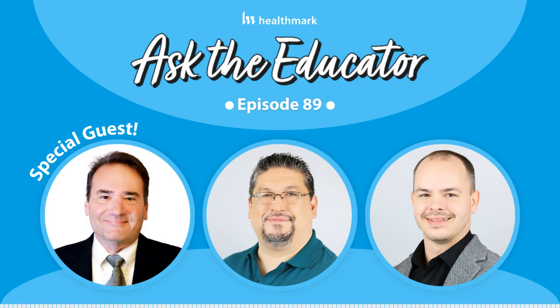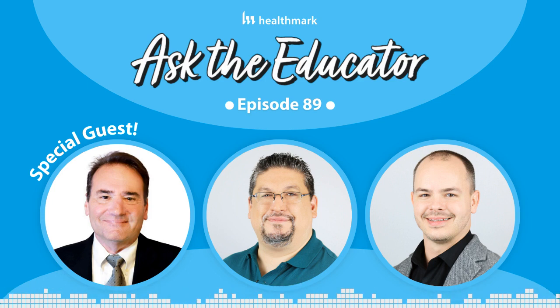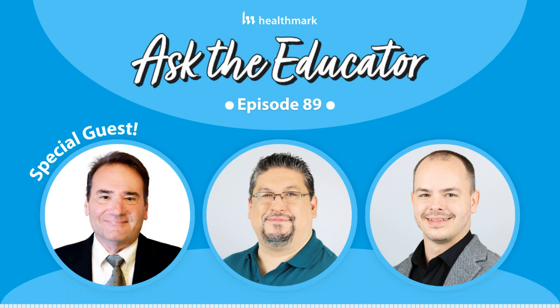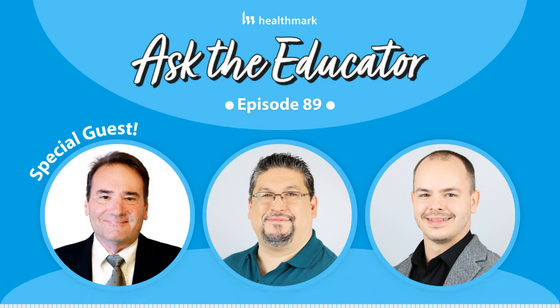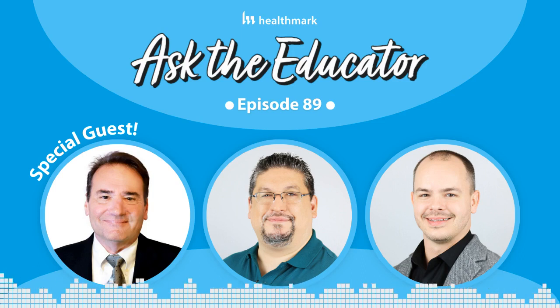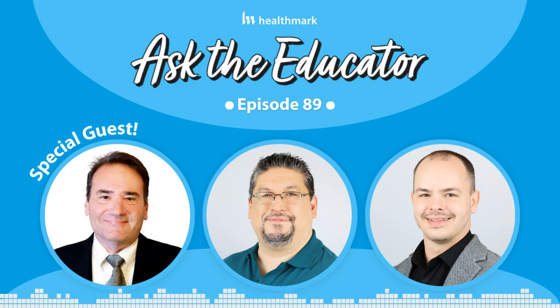That's a great distinction there. So worst case is the worst case in what you'd expect in normal or clinical use, and it is a gray area. I think the device manufacturer ultimately has to justify why they've defined worst case the way they have, but it's based upon the clinical use of the device. It's a little bit easier when we talk about cleaning, because you just talk about the lowest concentration or the lowest temperature, those kinds of things. But it's a gray area, and it's really important, as I mentioned in the webinar.